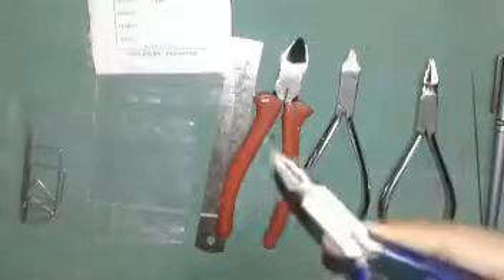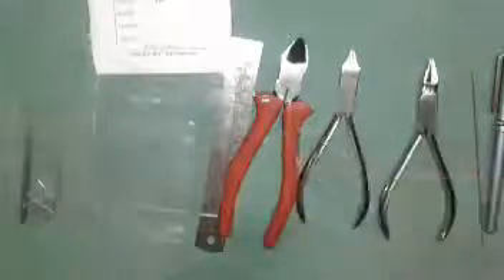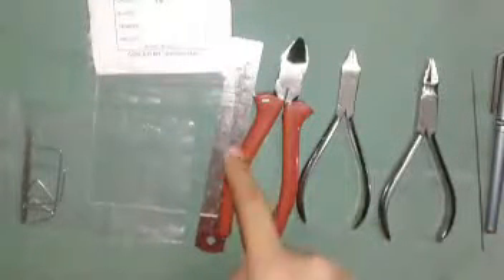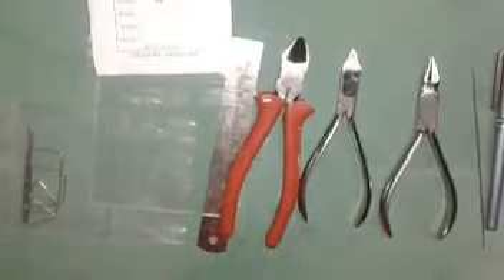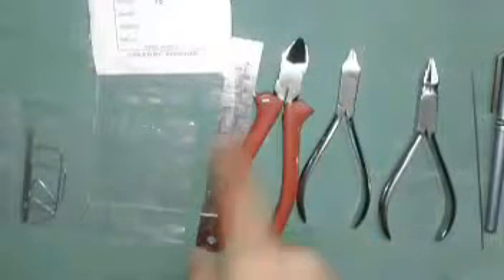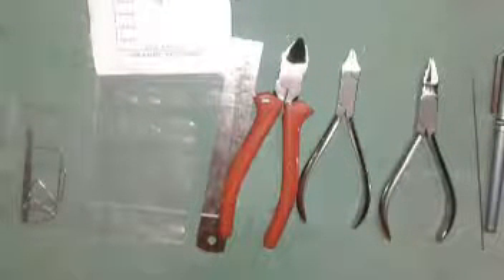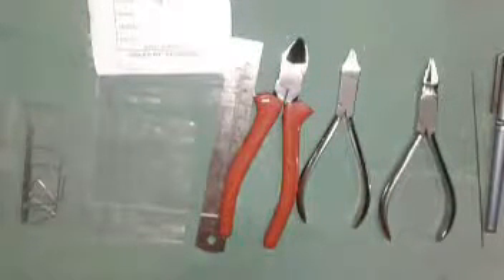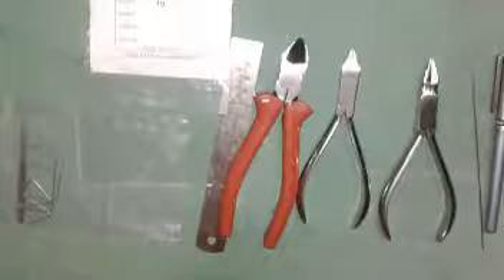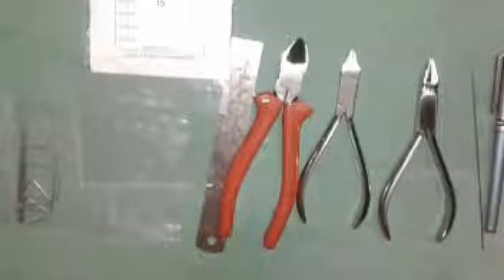Don't use this kind of pliers — by using those you won't get perfect wire bending. And this one is a cutter, which is used to cut the orthodontic wire. Also, a glass plate is needed. This small glass plate is not ideal; always use a big size glass plate. I will show that in the wire bending topic in further videos.